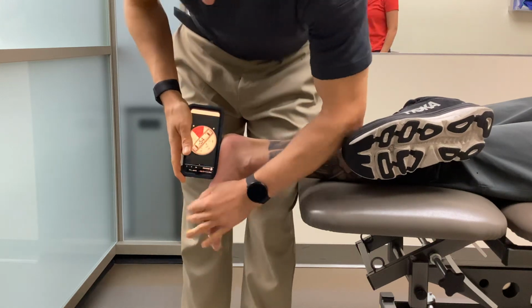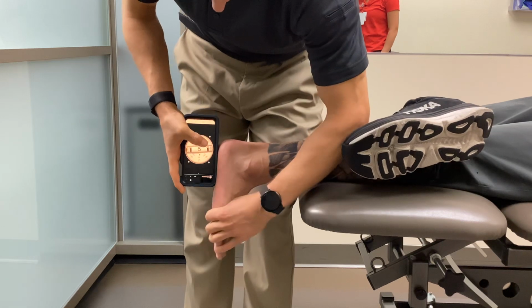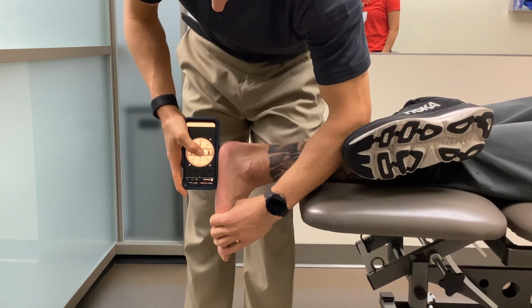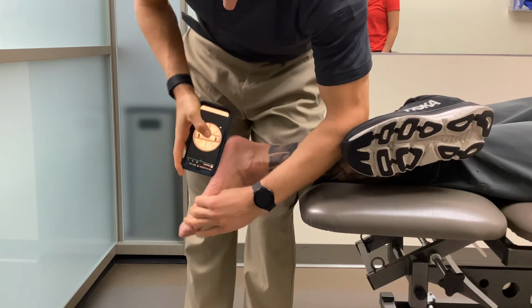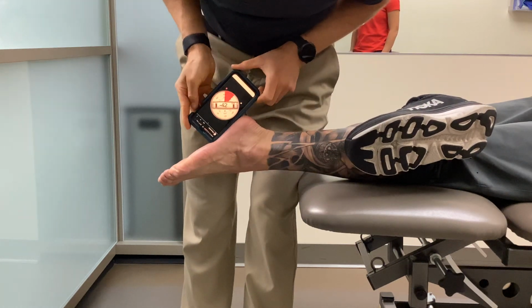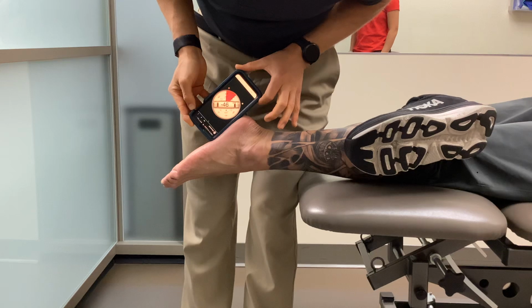Okay. If we wanted to look at active, so in this case, Eric, when you hear that beep, I'm going to have you do that same motion actively. Go ahead. Great, and that makes sense that he's a couple of degrees shy actively compared to passive.